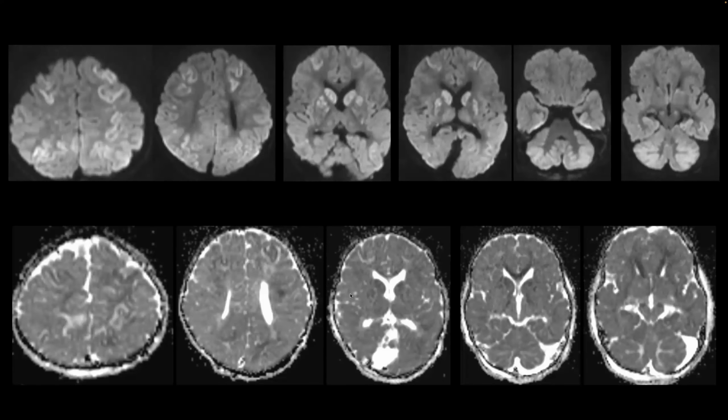I think I have the interval MRI, the intermediate one in the middle. So there were diffusion changes along the basal ganglia, patchy abnormalities out here, and also the cortical regions in the bilateral hemispheres, frontal, parietal and temporal lobes. This was discussed previously, and we raised the possibility of biotin thiamine related disorders. Hence, the child was started on biotin and thiamine.